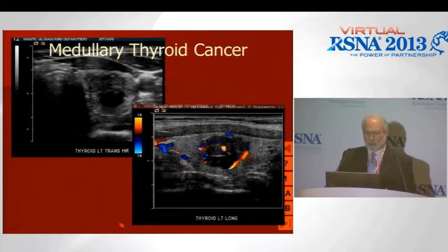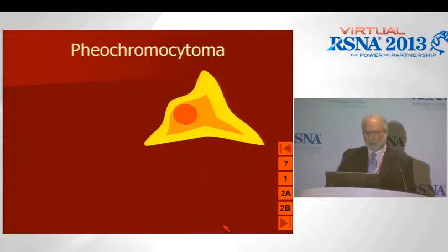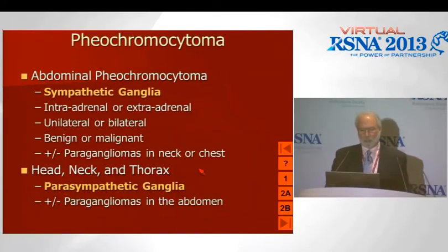So medullary thyroid cancer, nothing really specific about a lot of the imaging, a little bit hypervascular, it may become necrotic, it may pick up FDG and be very, very hot. Now I want to talk about pheochromocytoma for a second. It's an adrenal medullary neoplasm.